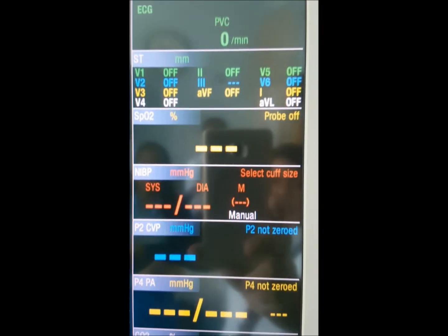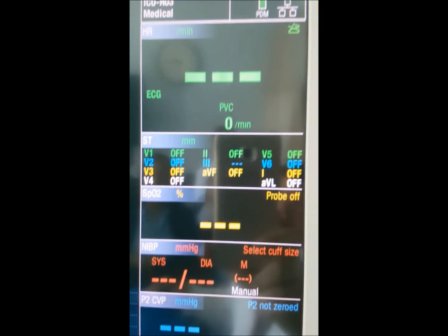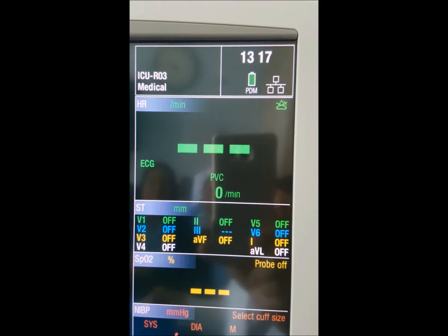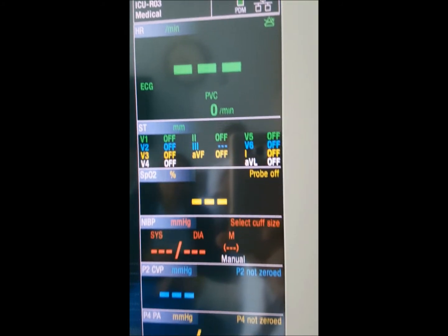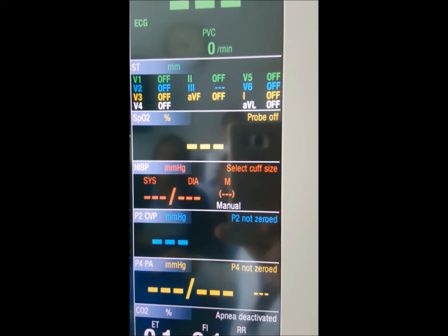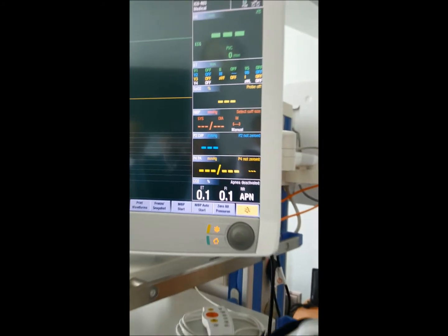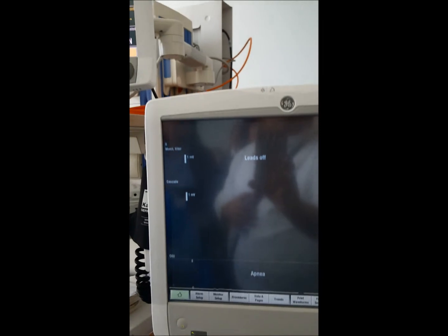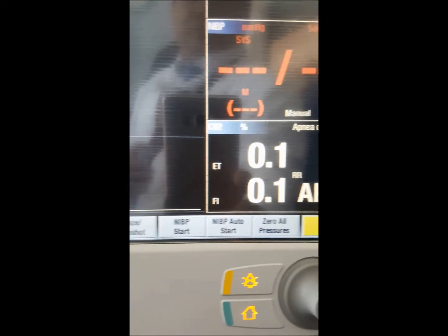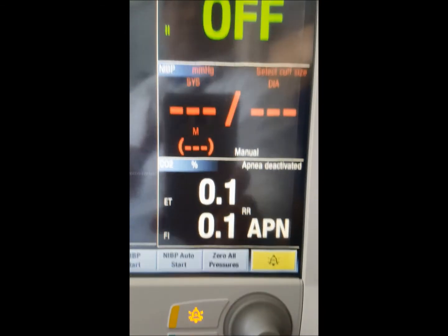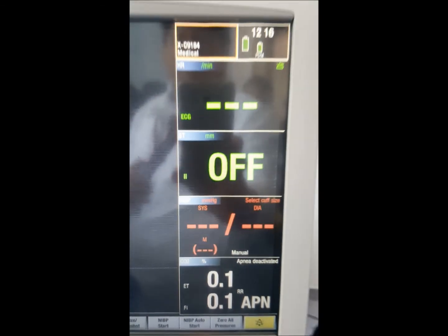Patient data can be retrieved from the Hospital Information System even after discharge from the monitor, but not from the monitor itself. To summarize: you should know the standby location, automatic interval settings, and how to switch off by pressing the button for three seconds. Now let's talk about the V100 machine.